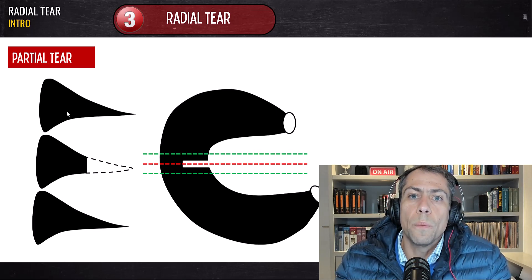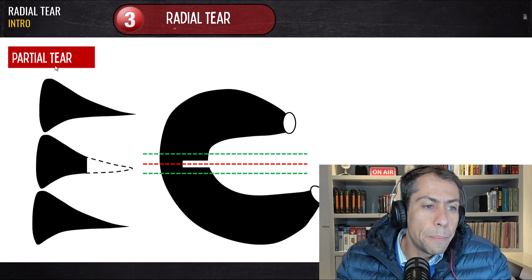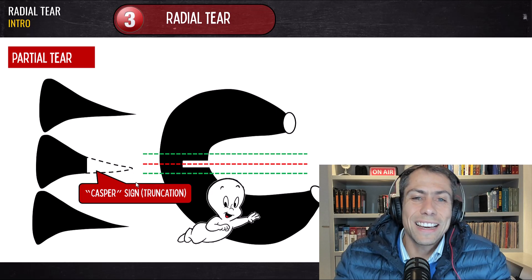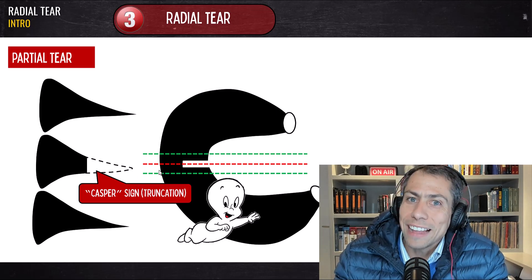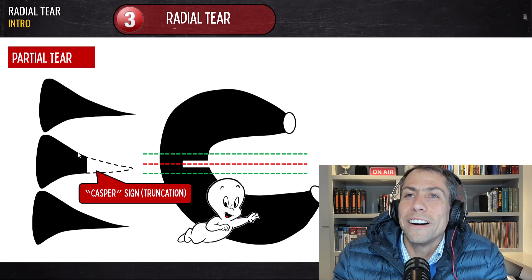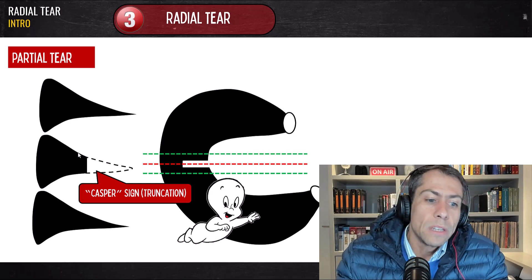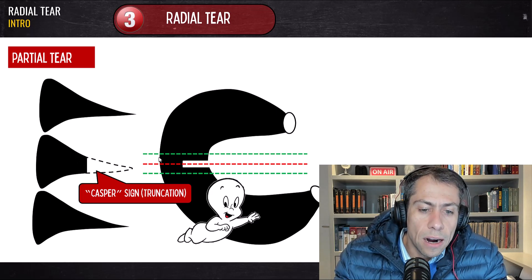One slice after that we will see the meniscus again. That is the difference between complete radial tears — where we have the ghost sign and the meniscus doesn't appear in one cut — and the partial tear, where just a portion of the meniscus doesn't appear. This is the truncation of the meniscus. I also like to call this the Casper sign, because it's like a little ghost — a partial ghost sign. But the more scientific name for our report is the truncation of the meniscus.